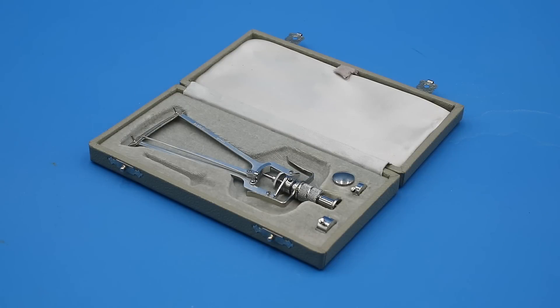Hello everyone and welcome to another mystery object answer video on our own devices. I'm Jean Messier and yesterday I showed you this object which I said was a medical instrument used for probing a particularly sensitive part of the human body. Hopefully most of you guessed that that body part was the eyeball.